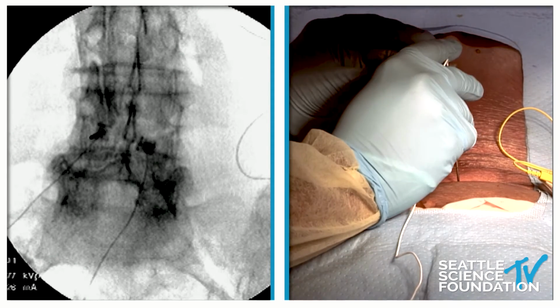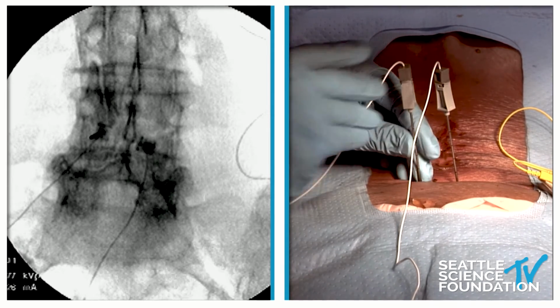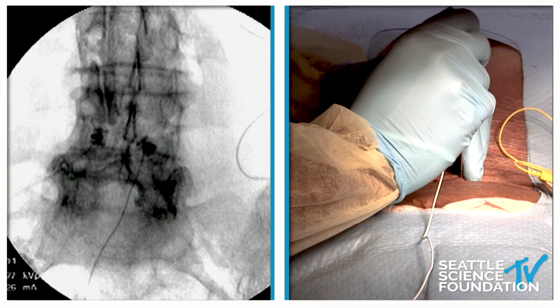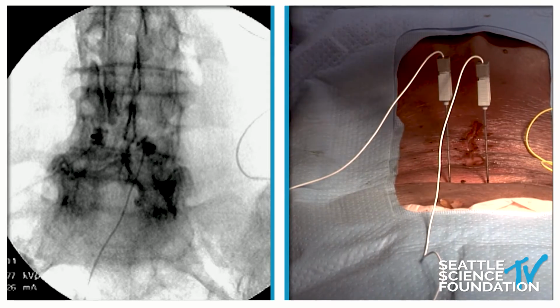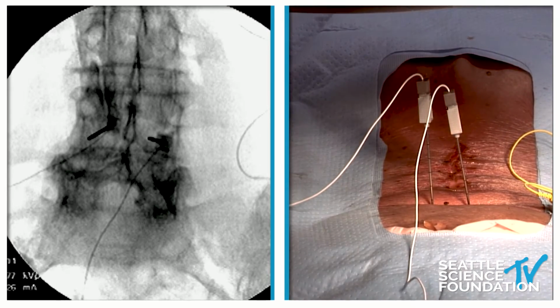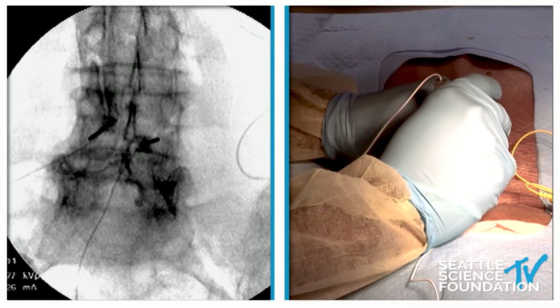All right. So I'm starting, as we've talked about all day, bone is home. So I know I'm on lamina. And so that needle on the right is a little bit too medial, so I'm just going to pick it up to the skin, pull the skin out laterally, and again, come down. I can feel that. And now the tip is too medial, so I'll just aim the tip lateral. Perfect. So really, it's where the tip is, not so much how the needle is situated.